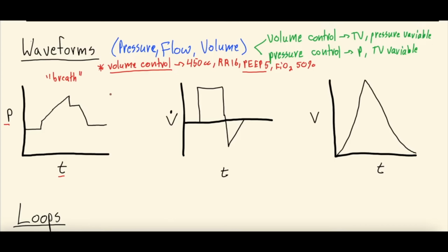So the things we have are, let's see if we can draw, probably not, there's a patient, right? A stick figure patient, they're lying down, here's their arms lying at their side, here's their head, here's their mouth, eyes, and they have an endotracheal tube in their mouth, hooked up to the ventilator machine, right? And the ventilator machine has our waveform stuff, but the ventilator is pumping volume into the endotracheal tube that then goes into their two lungs. And the pressure in this closed circuit, lungs, trachea, endotracheal tube is what's being shown here.